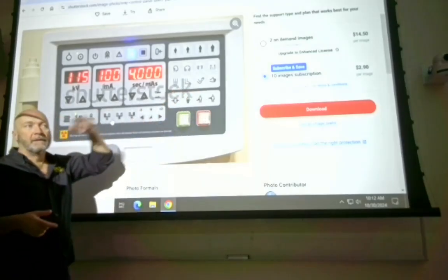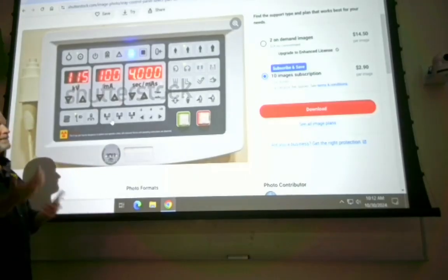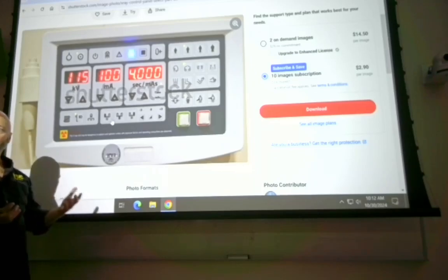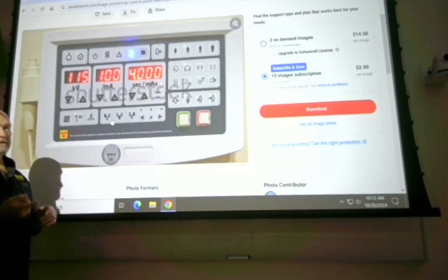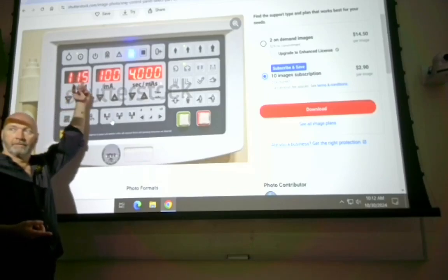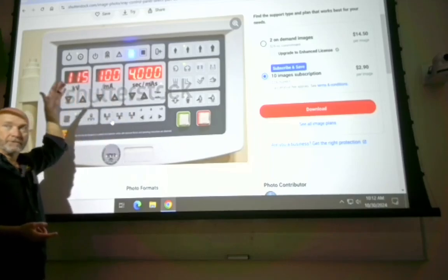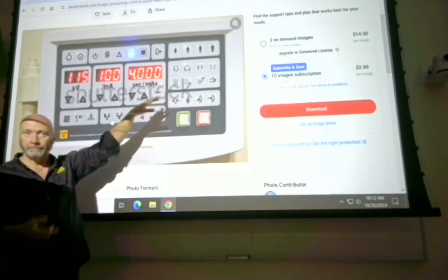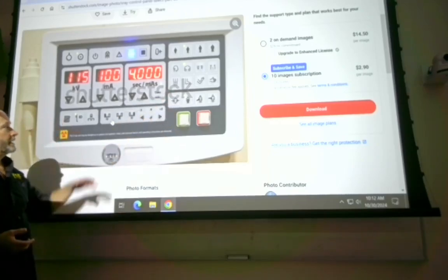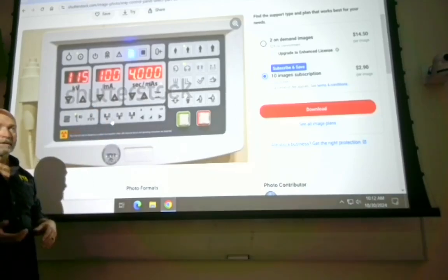Okay. So what are we doing with all this? I mean, why am I talking about all this? What are you doing with each one of those things I just mentioned? Setting technique, which specifically is changing your KVP, MA, and time separately so that you change your quality and the quantity of x-rays you create, so you give a patient the proper dose. Same thing with these things, providing you position properly.